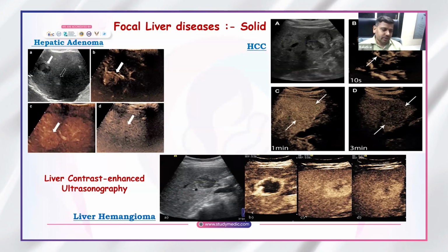As we can see, the liver hemangioma is a typical hemangioma, which can be seen as a somewhat irregularly marginated but well encapsulated, heterogeneously hypoechoic lesion in the bottom images. On contrast enhanced ultrasound examination, the lesion is showing intense enhancement along the margins during the early phase, and as the examination progresses, we can see peripheral filling in of the contrast, which is typical of a hemangioma on all contrast examinations. We can see on CT and MR also, a similar appearance.